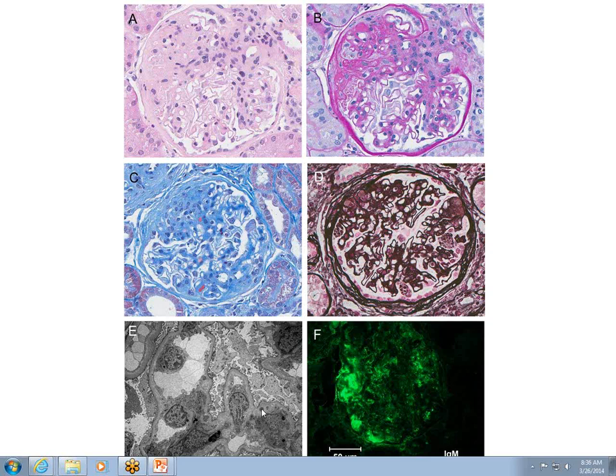Sometimes we see a little bit of mineral or a little bit of lipid get here in this disease process, and it's usually here. So when I describe it, I would talk about electron-dense material, but I would not interpret those as immune complexes.